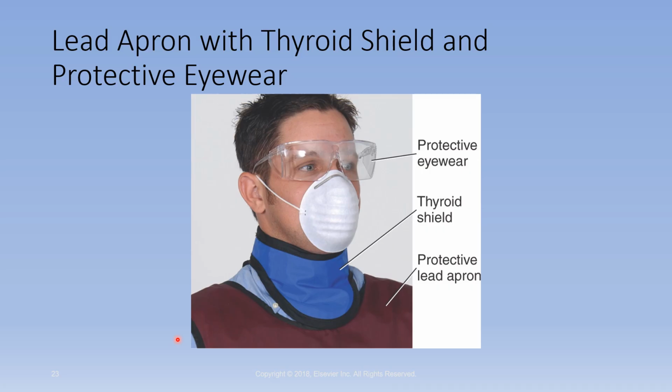You can see in table 12.4, the protection summary chart. There are lead tower drapes on the fluoro tower that help protect us. We wear protective lead aprons of 0.5 millimeters lead equivalency, and that is because we operate above 70 kVp. The lead gloves should be 0.25 millimeters of lead equivalency.